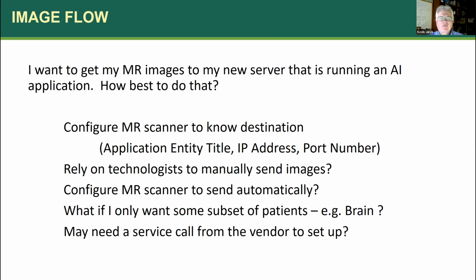If I have a lot of MR scanners, I've got to do this on all the MR scanners at my institution. I've also got to think through, okay, am I going to rely on my technologists? How are they going to send these images? Are they going to manually send the images at the end of each case? Well, they're busy getting the patient off of the table, taking out the IV if there was contrast. They're dealing with a whole bunch of stuff as well. It'd be kind of nice to automatically send the images.